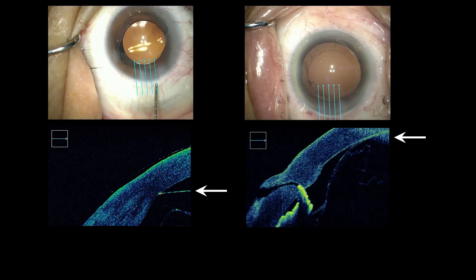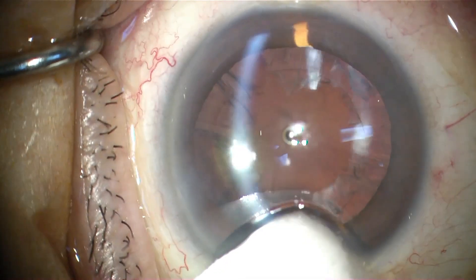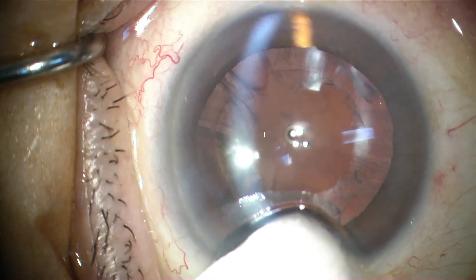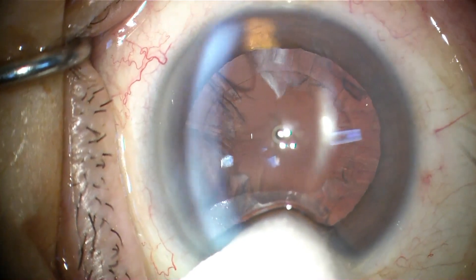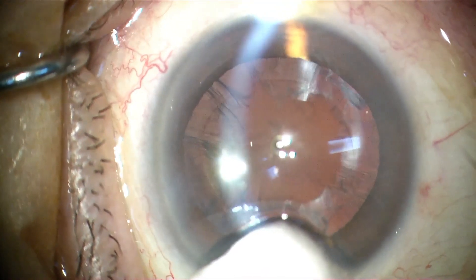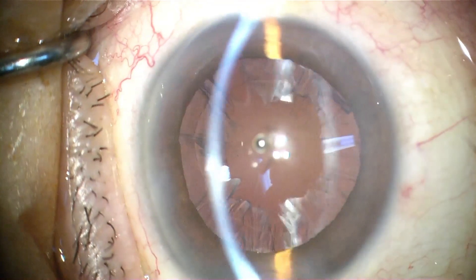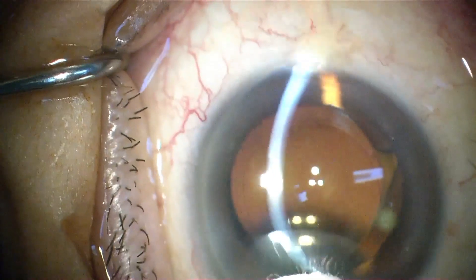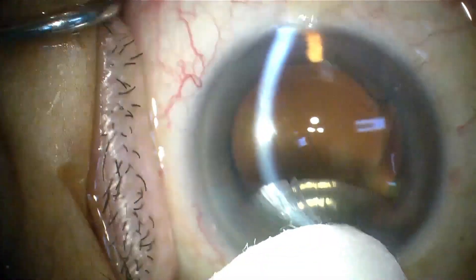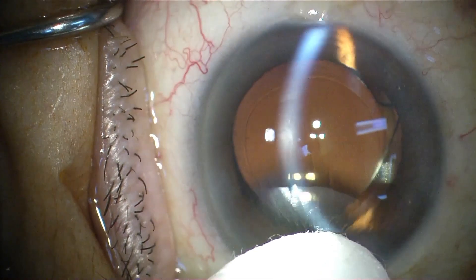The posterior capsule or intraocular lens could even contact the corneal endothelium. We propose applying a downward pressure on the incision using a cotton swab immediately after the withdrawal of the handpiece tip for about 30 seconds — called swab pressing. If this simple technique is applied intraoperatively, it may not only seal the incision instantly but also help prevent anterior chamber collapse and related damages without injecting a solution to hydrate the stroma.